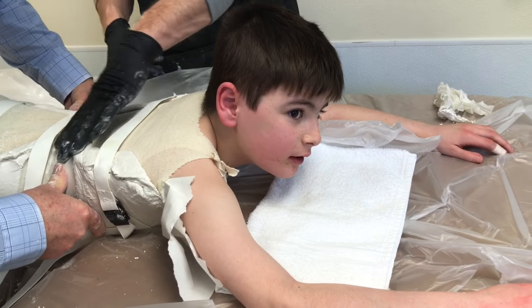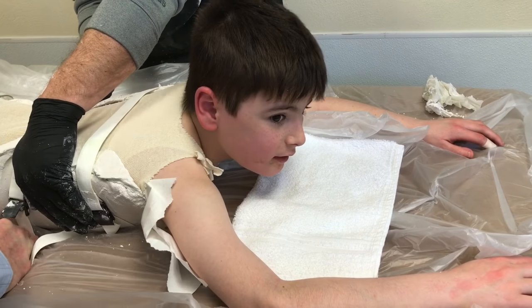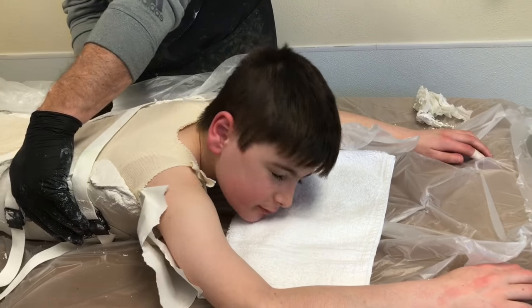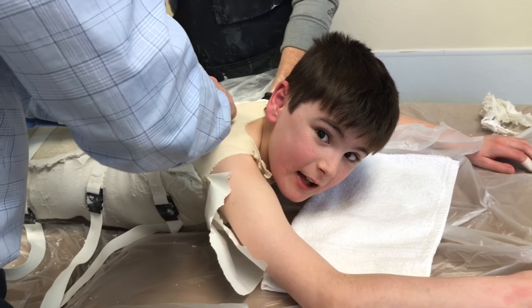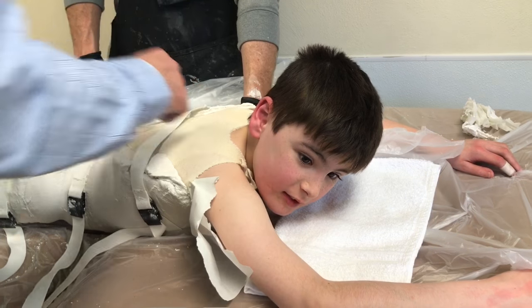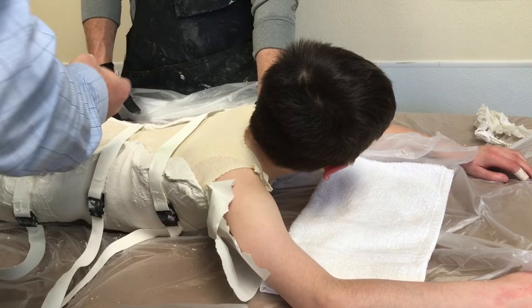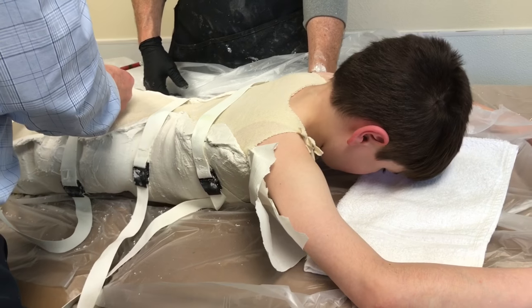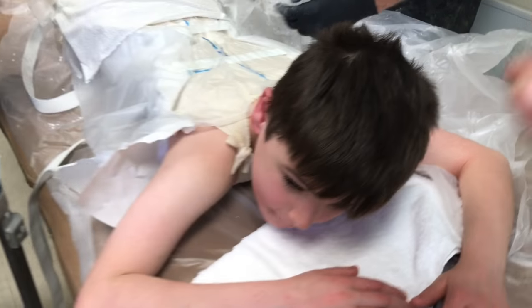Who did you say you're gonna look like with your brace on? You're doing good. Are you doing okay so far? Don't you dare say I'm a turtle!